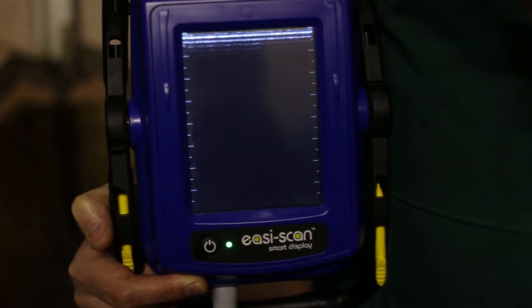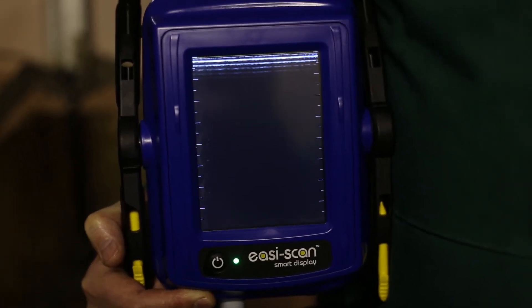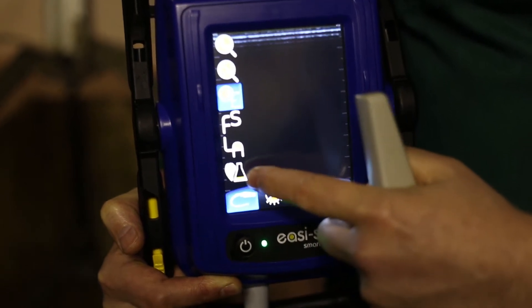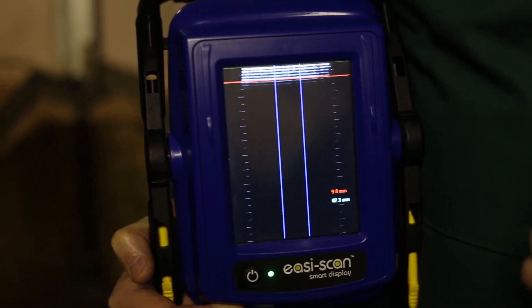From here the scanner is active. We can then select back fat by tapping on the screen, selecting the probe, selecting back fat, and we're now ready to scan.